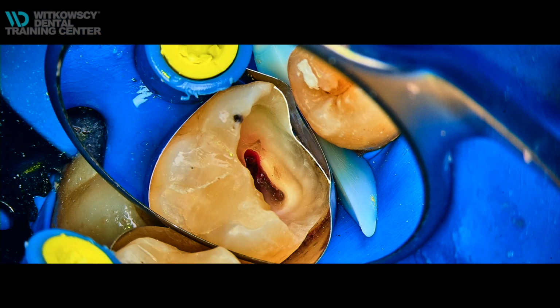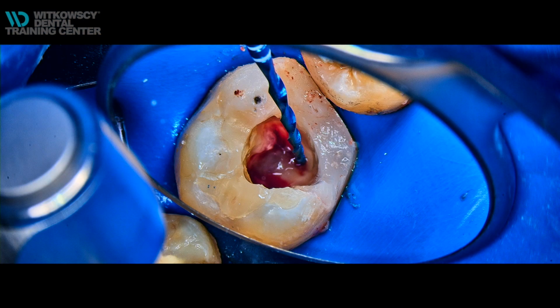So the first problem that I encountered was with the restoration of this tooth. And of course, I needed to use a proper wedge. In this situation, I used a wedge from the Palodent system. Take a look at this. I restored the tooth and I thought that now it is easy, but unfortunately, the problems had just started.